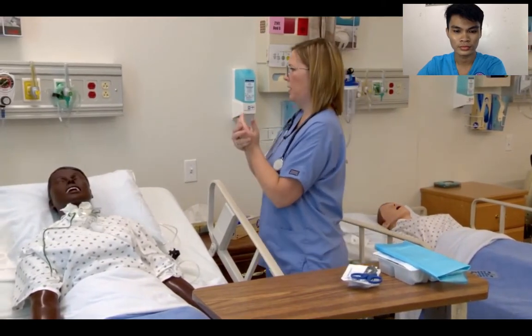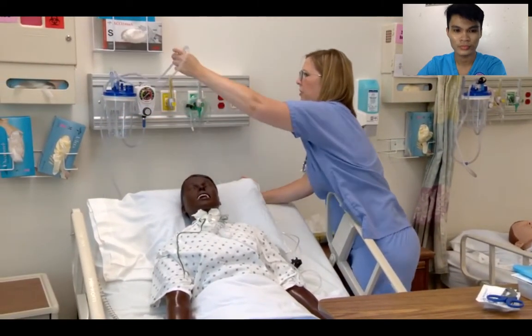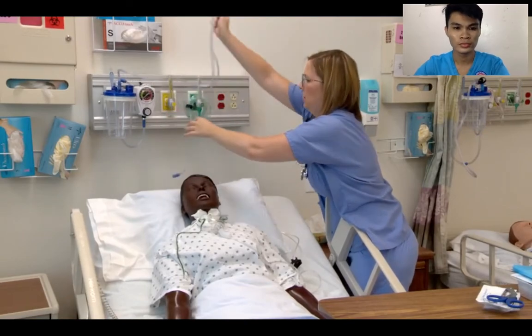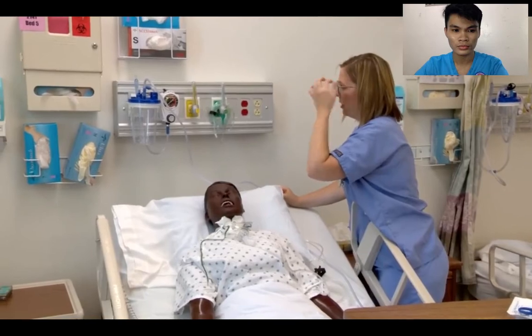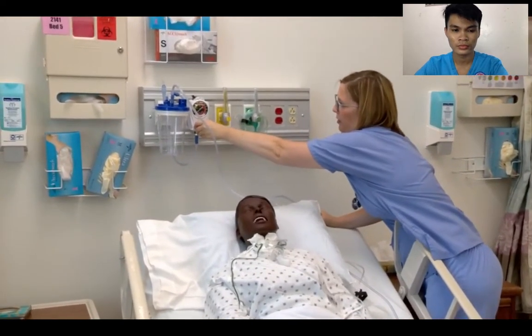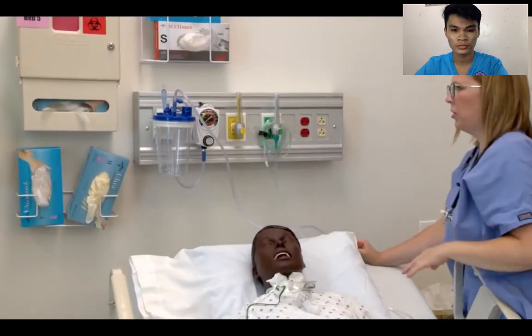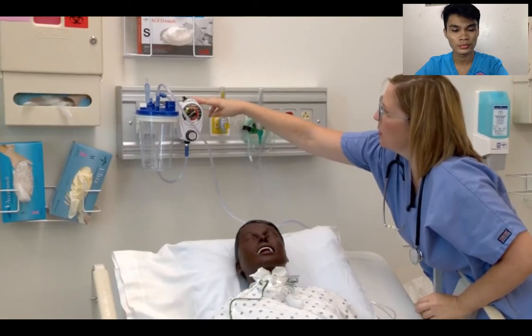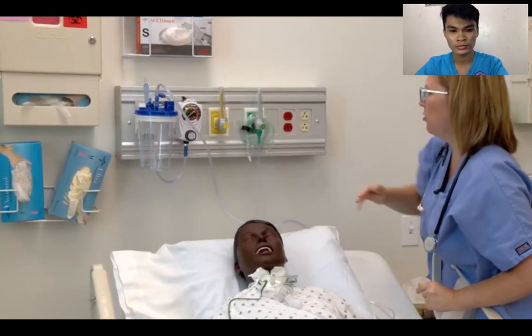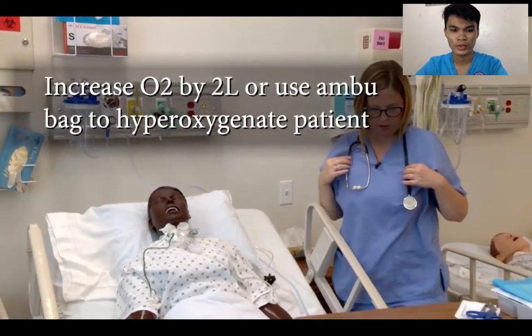Okay, so I'm going to grab my suction catheter here from the wall. For adults, we want 100 to 120 on the suction level. For pediatrics, it's 80 to 100, and you want to make sure that the suction is actually set to continuous. Okay, so it's always applying pressure for us.